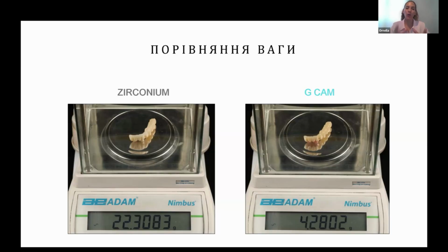If we weigh the root and we weigh the crown of this tooth. With a zirconia or metal ceramic, we are multiplying the weight of the natural teeth by 6, okay? So this is also a thing that we need to think about, that we are going to provide more comfort for our patient if we have lighter prosthetics, okay?